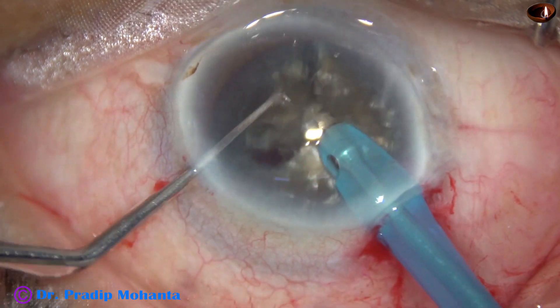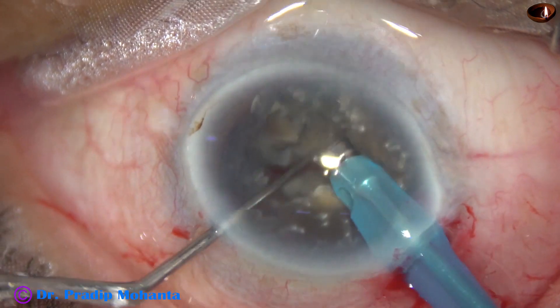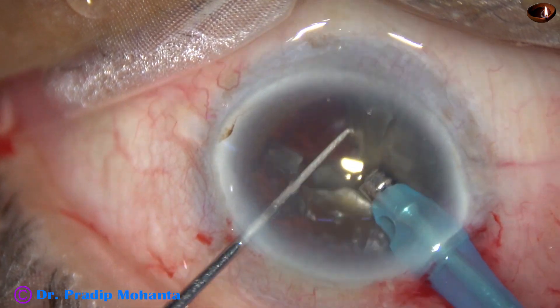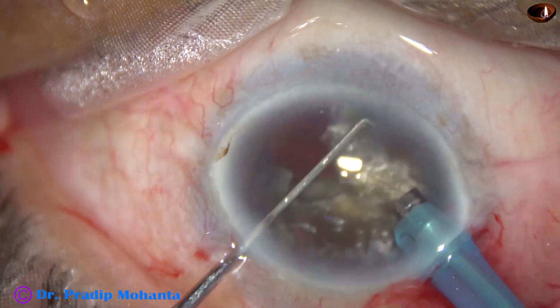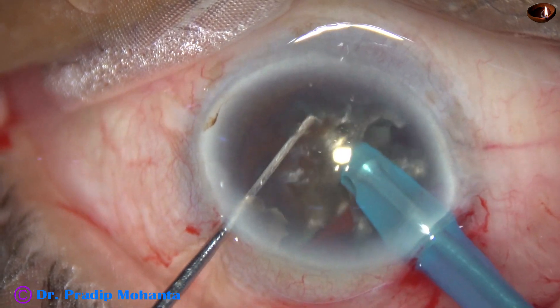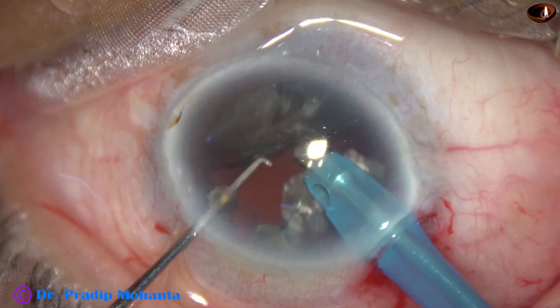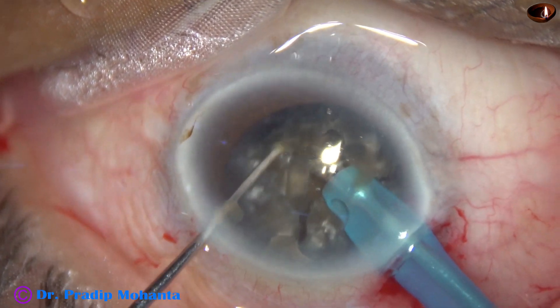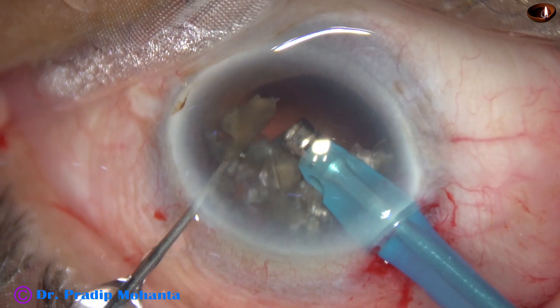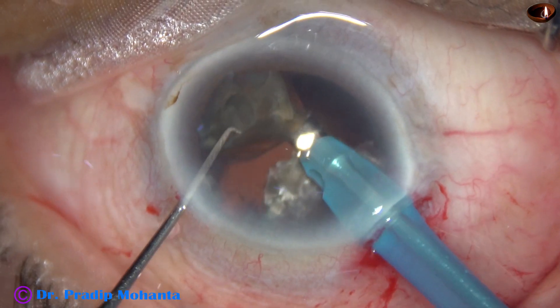One hemi nucleus is then divided into pieces. I am trying to get the apex of the triangular pieces. I have emulsified two pieces. And now I come to the other hemi nucleus. Ultrasonic energy being used is 85 percent, flow rate is 45 ml per minute, and vacuum is 450 millimeters of mercury.